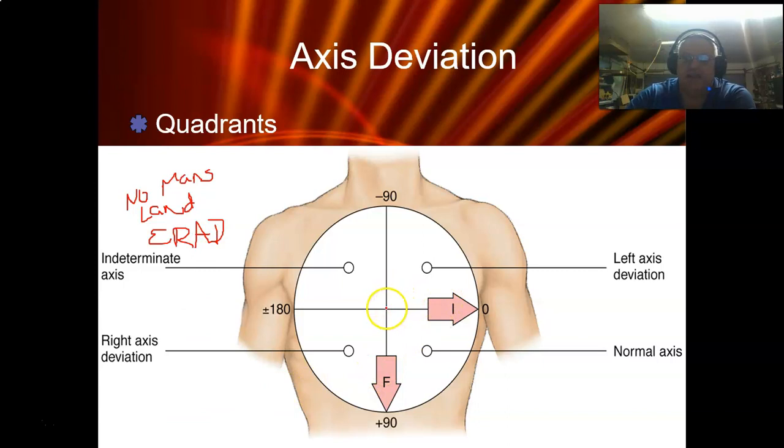And again, if the signal's flowing from there anywhere over here, there's only one place, guys, that it can start from. The only place that it can start is the ventricle, which is the reason that we use that to determine whether a person is in ventricular tachycardia. So this is our tool to tell that, all right?